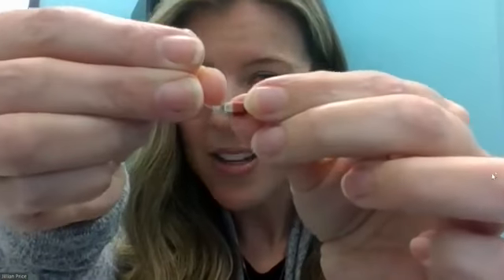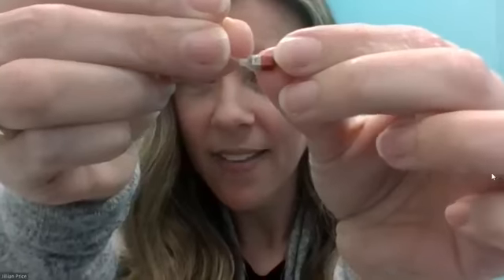But just before that, where this clear part is, that's where they've written the length of the receiver and the power. So I'm going to try and show you this. There is a 1. Yeah, you can't see it. There is a 1 there. So right in here, there is a 1.